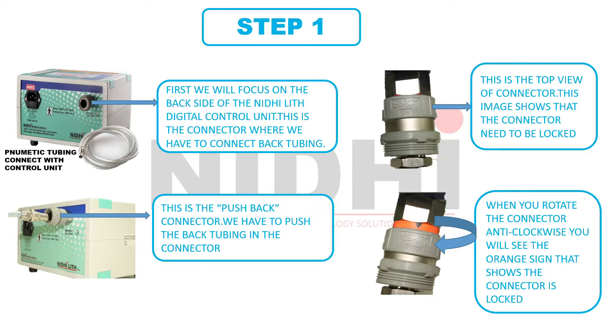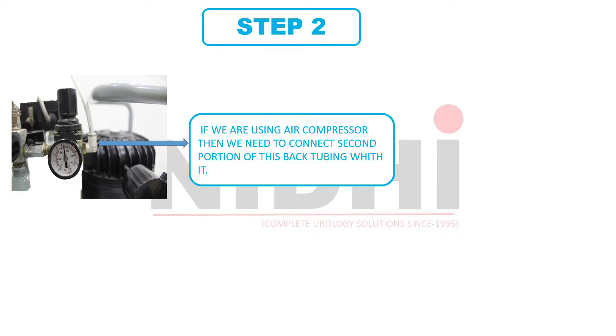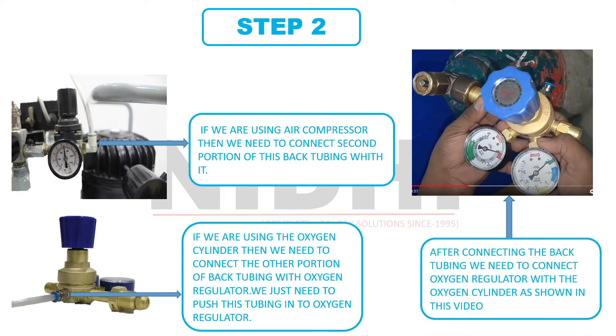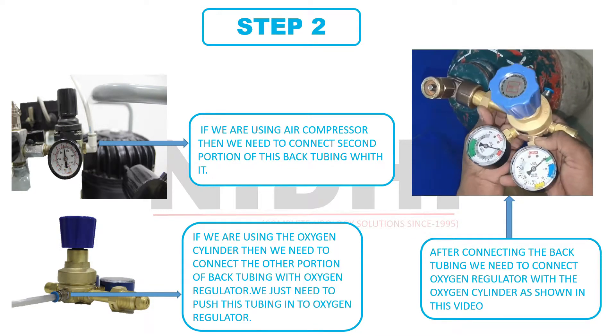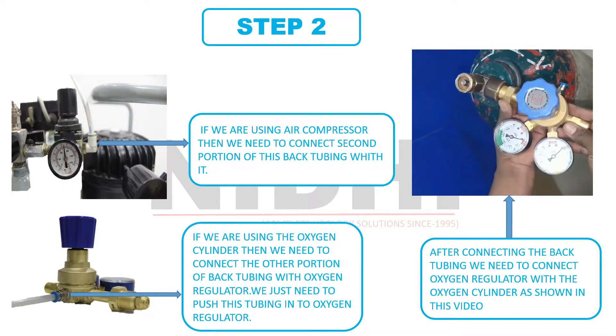Here we have two alternatives for air supply: one is an air compressor and the second is by using an oxygen cylinder. If we are using an air compressor, then we need to connect the second portion of the back tubing with it by gently pushing the tubing, as we can observe in this image. If we are using an oxygen cylinder, then we need to connect the other portion of the back tubing with the oxygen regulator — we just need to push the tubing into the oxygen regulator. After the successful connection of tubing and oxygen regulator, we then connect the oxygen regulator with the oxygen cylinder, as we can observe in this video.